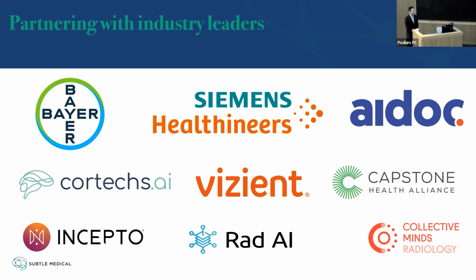Not really. Particularly on the clinical side, we don't have access to the raw acquired measurement data. So we can only do data consistency with respect to the input DICOM image. And is that input DICOM sometimes magnitude only? Because if you lose the phase... Yeah, currently we mostly just rely on the magnitude image. We also did some experimental work to try to add the phase image as another channel, but we didn't see that much improvement compared to only using the magnitude image. But definitely we can further try along this line. Yeah, thank you.